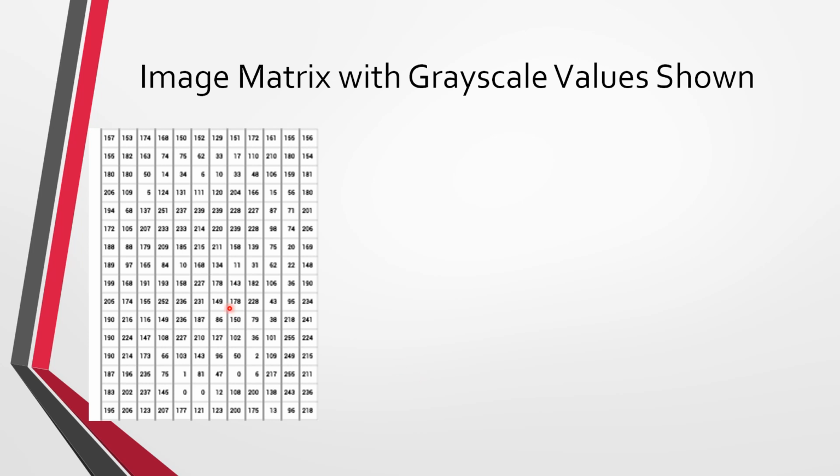But we have values assigned to it, and if we look very closely at the values, we can see that the grayscale of this image is probably going to be 8 bits. It's probably going to be 2 to the 8. No value is above 255, and there are zeros. To get that, we take 2 to the 8, which is 256, and we subtract 1, which becomes 255, because we're also utilizing the 0. That's where the minus 1 comes in. So from 0 to 255 is 256 different discrete values that we can utilize for each cell, and we've assigned a value to each of the cells.